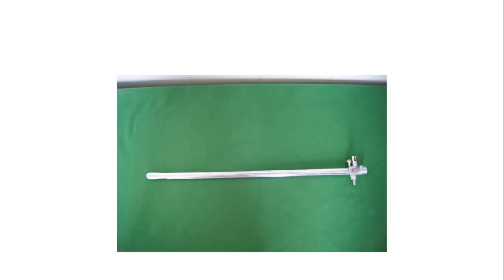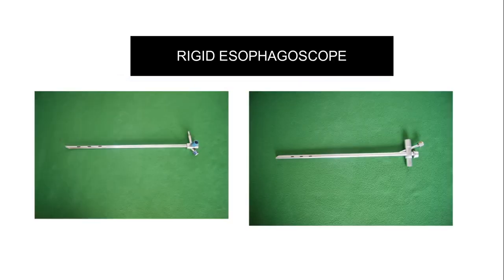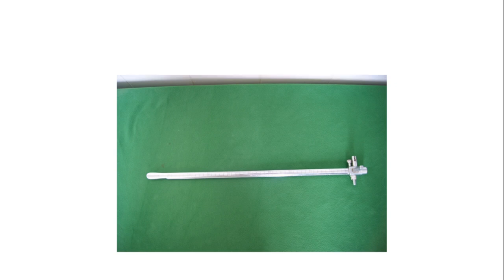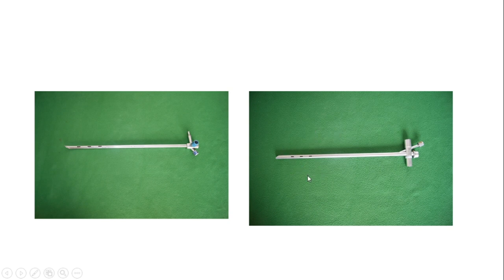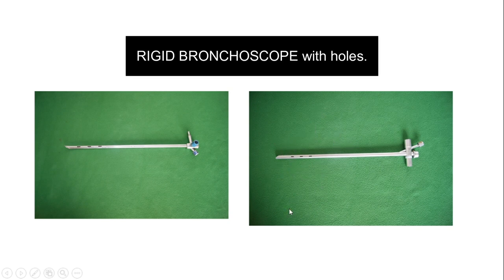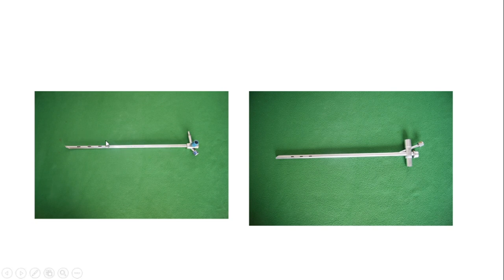This is the esophagoscope and this is the bronchoscope — it is very important to differentiate them. At the lower distal end of the bronchoscope, there are holes. The function of these holes is that when the bronchoscope is placed into one bronchus, the contralateral lung still needs ventilation. The holes allow air to pass so that the other lung is also ventilated.